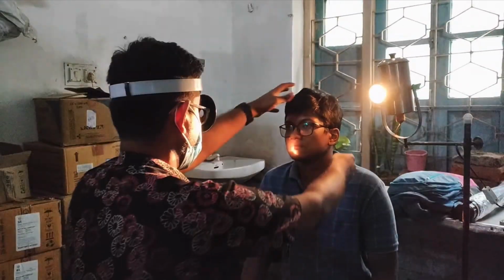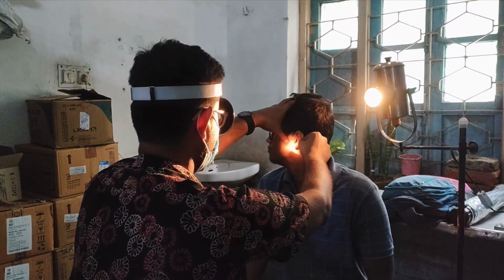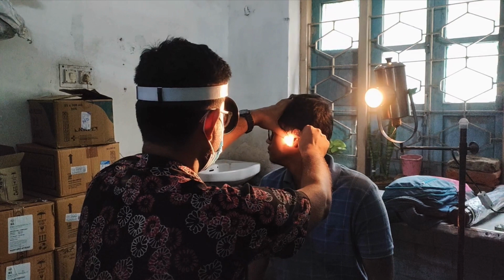Now first I'll show you how you will examine the ear with a bull's lamp and head mirror. Initially I'll examine the external auditory canal and, if possible, the tympanic membrane without an aural speculum. Then I'll examine with an aural speculum. So first I'll turn the patient. I'm examining the left ear, so I'll turn the head of the patient to the patient's right so that the left ear of the patient faces me.